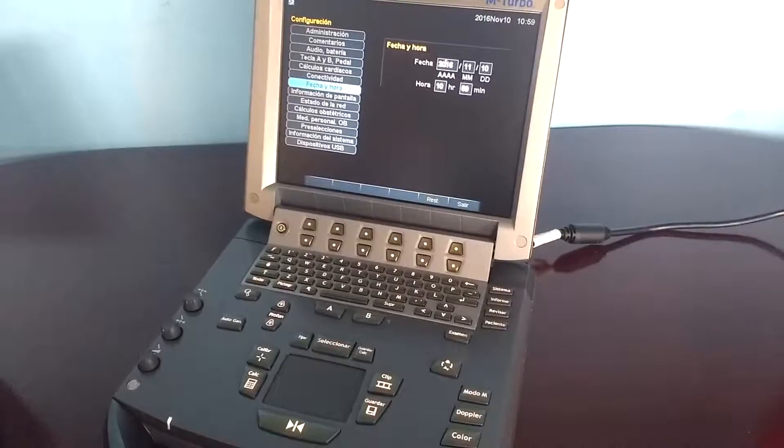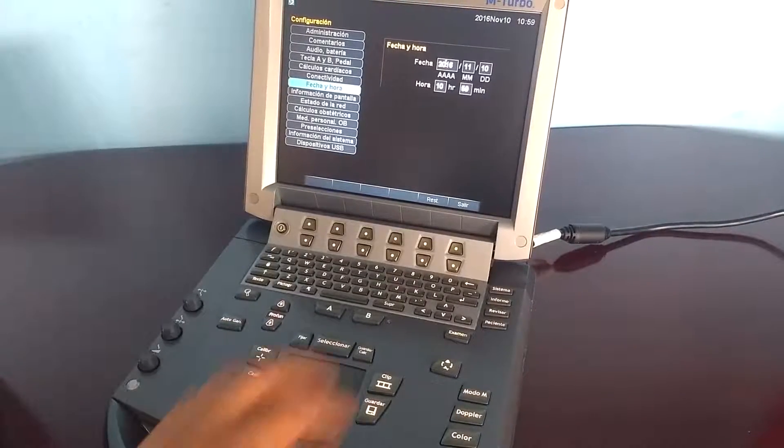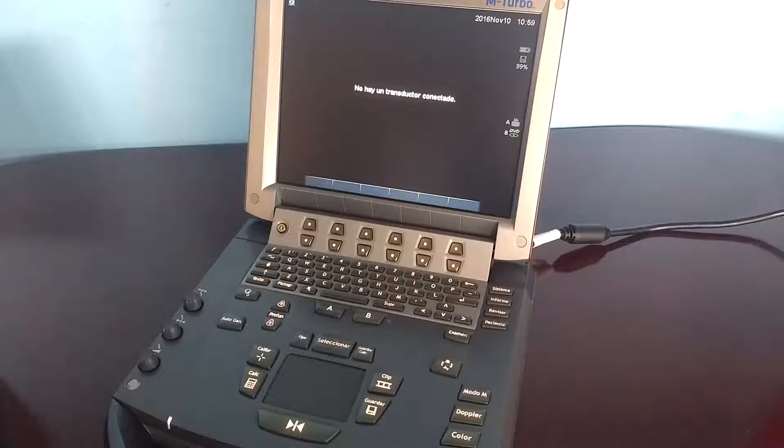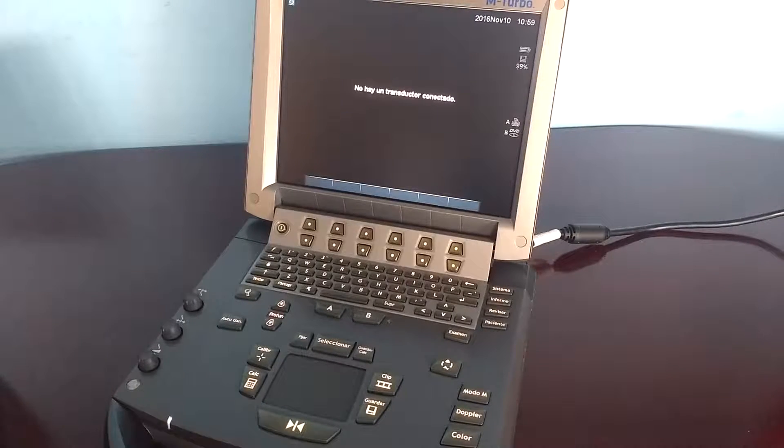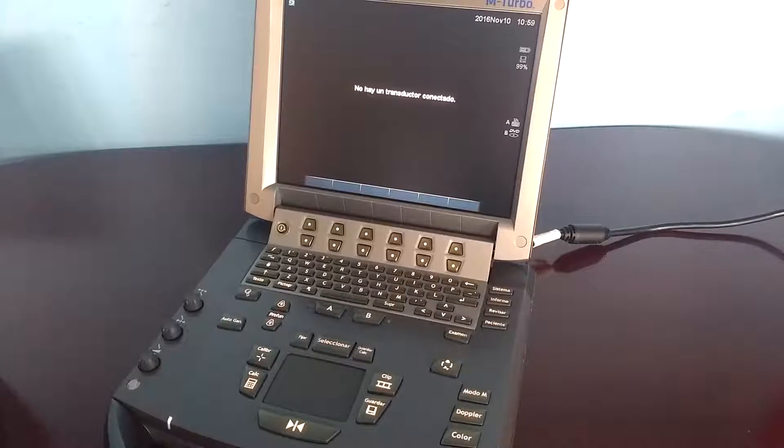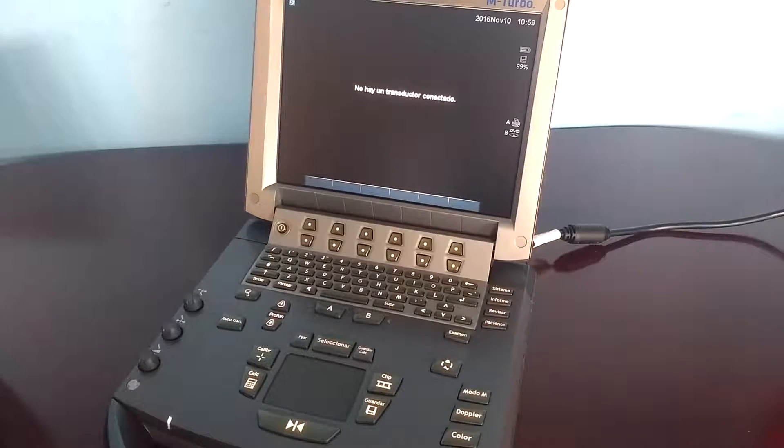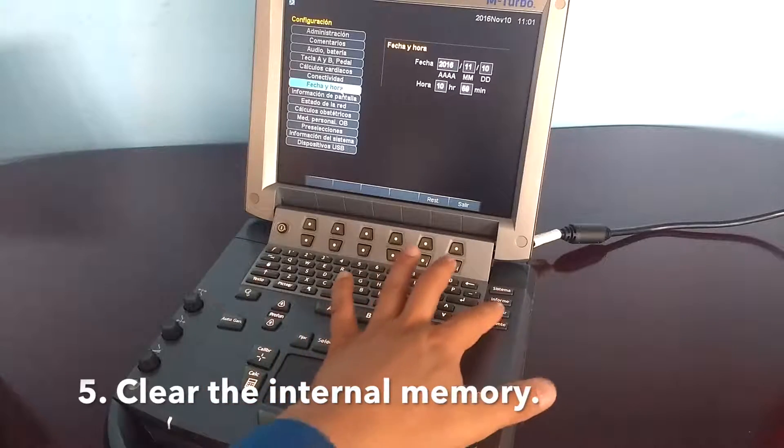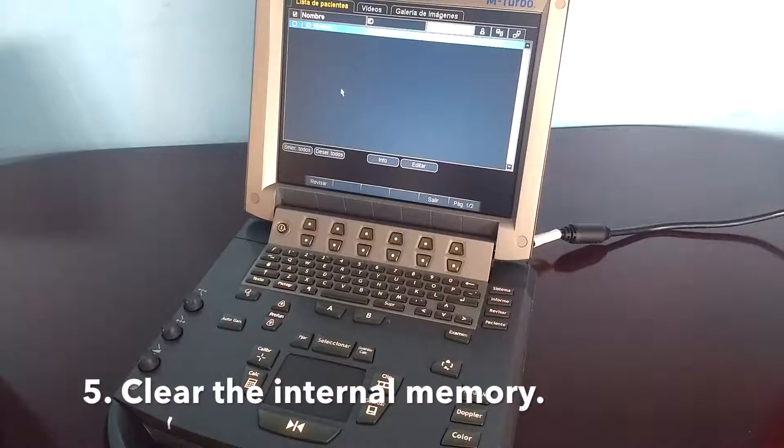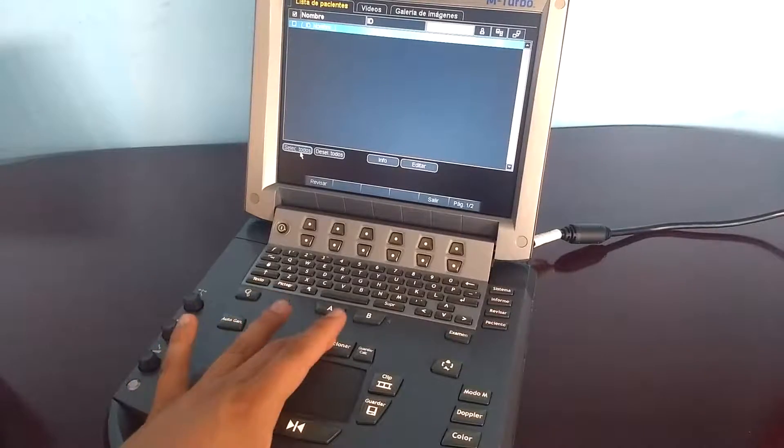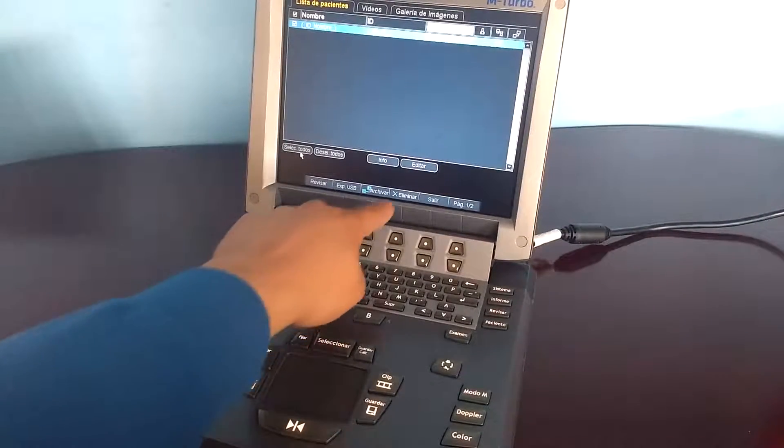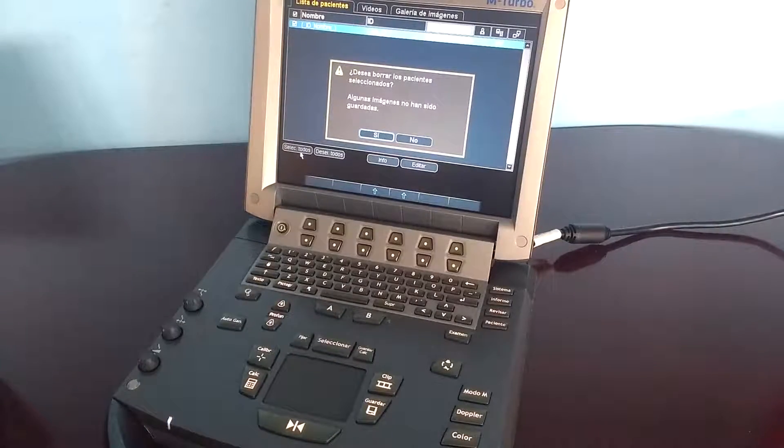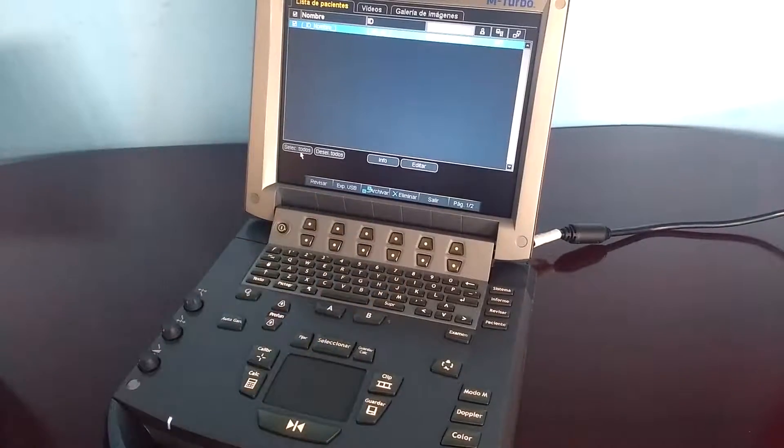Clear the memory. Erase every patient and image stored on the system. It's convenient to do a backup before this step. You can see my other video to see how to do it. To clear the memory, press the REVIEW key and select everything. Then press the delete button and confirm.